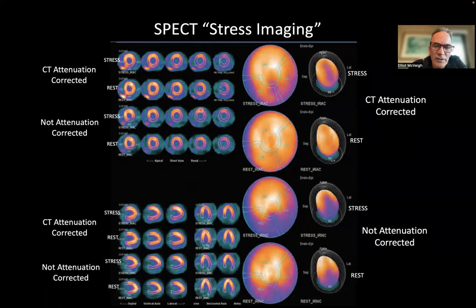From this location, it is easier for a photon to get out and get detected than it is from this location. It's deeper in. So that term has to be entered into the model for calculating the relative concentration of agent here. You have a source term, which is the thing that we're trying to image, and then an attenuation term, which is proportional to all the pathways from there to the detectors, right? And when those attenuation corrections are done, the pictures do change.